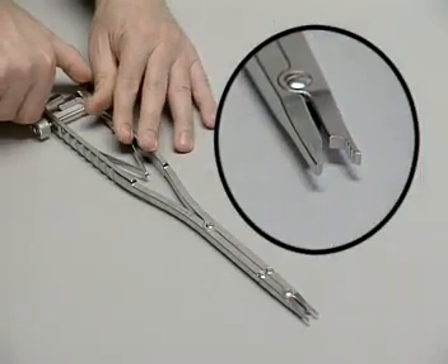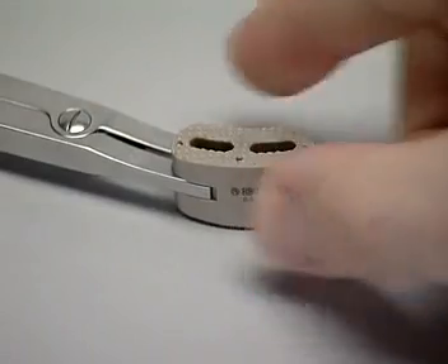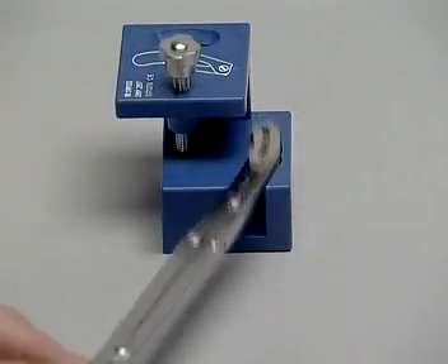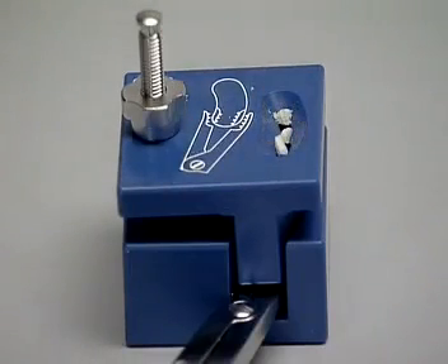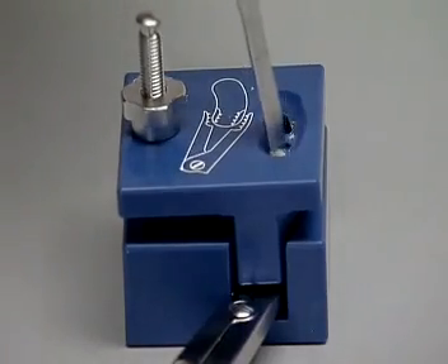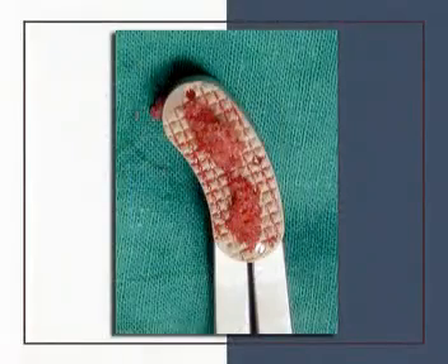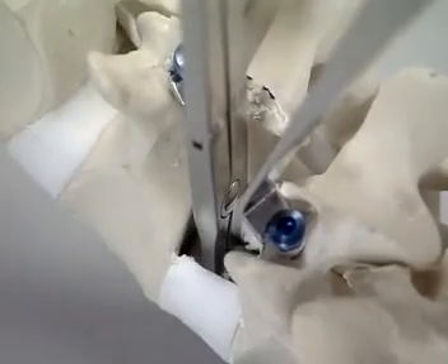The implant holder has jaws to grasp the serrated slots on the cage; a cage corresponding to the trial implant is selected. The short jaw of the holder with three teeth matches the concave side of the cage, and the speed nut on the handle is tightened. In the clinic, the cage is filled with bone graft material: the packing block is opened, the cage is inserted, the packing block is closed, and the knurled nut is securely tightened. The bone material or bone substitute is introduced and the bone impactor is used to pack the cage. The cage must be filled completely.